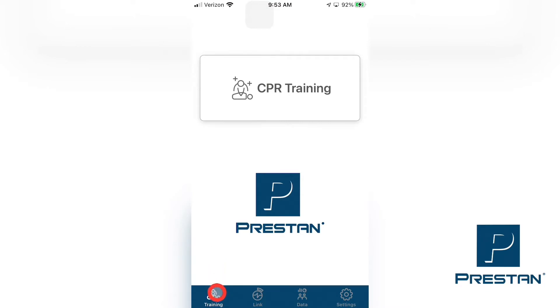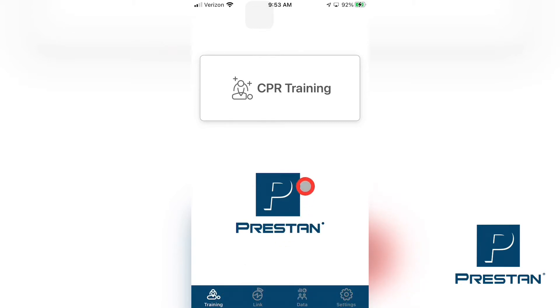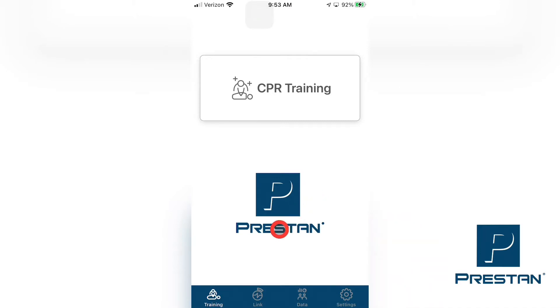These include the Training tab, the Link tab, the Data tab, and the Settings tab. The Training tab allows the instructor to monitor the training of up to six mannequins per device, in real time.